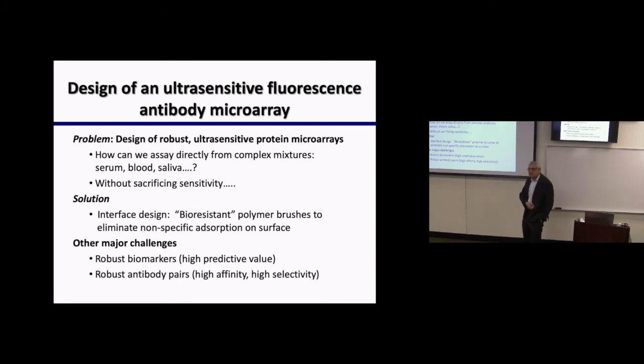So I decided to go into the field of in vitro diagnostics because I thought, it's in vitro, it should be easier than trying to put this surface back into the body. And there is lots and lots of work done in clinical diagnostics and lots of papers, even in Science and Nature, where people stop at working in buffer, which is completely useless, because getting something to work really well in buffer doesn't tell you whether it'll work in mucus or blood, the really challenging environments.